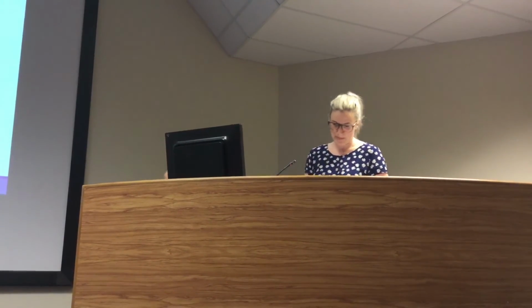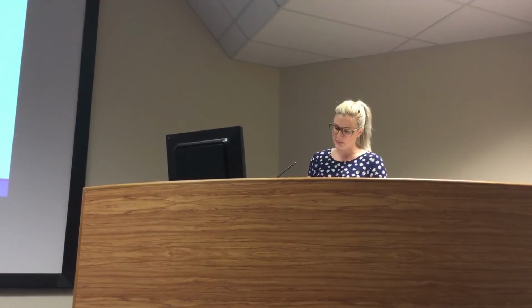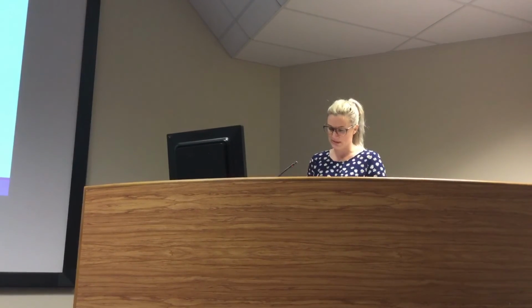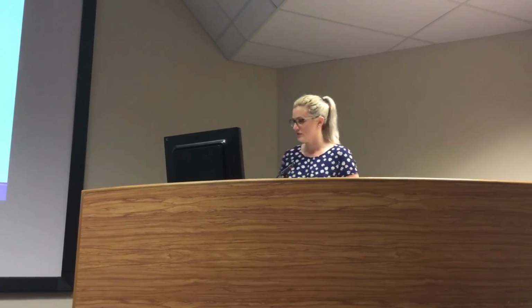Okay. So the umbilical artery impedance indices increase when there is a decreased end diastolic flow, reduced placental perfusion, and intrauterine placental insufficiency as seen in IUGR. Absent or reversed umbilical artery end diastolic flow are particularly ominous. So this is what I said here.